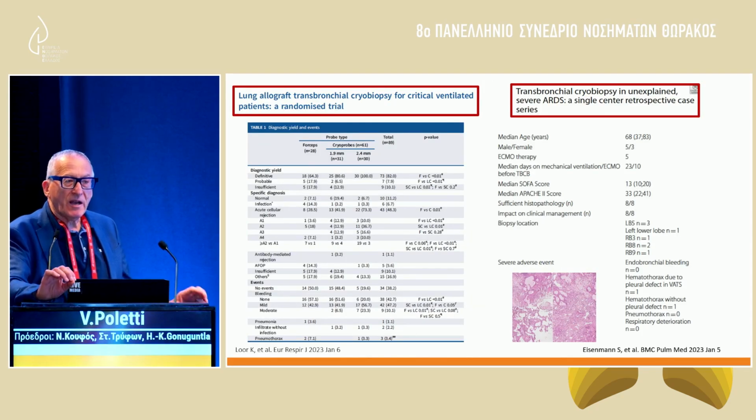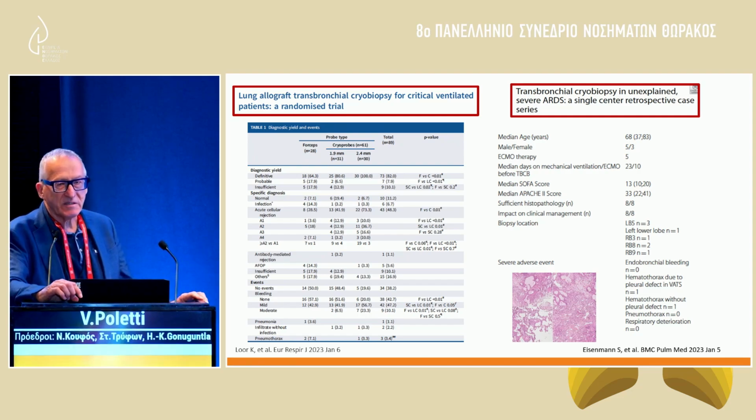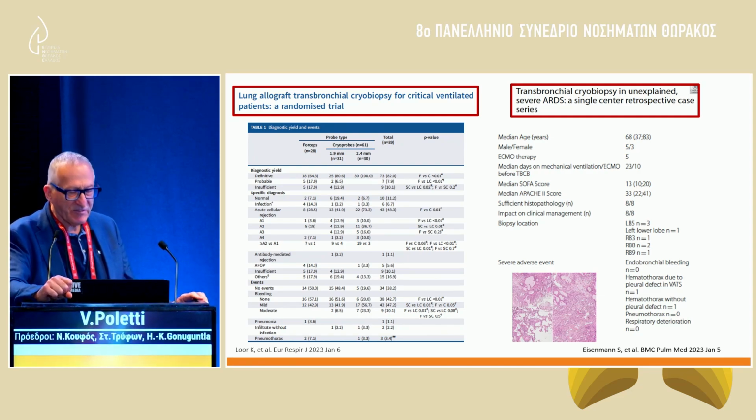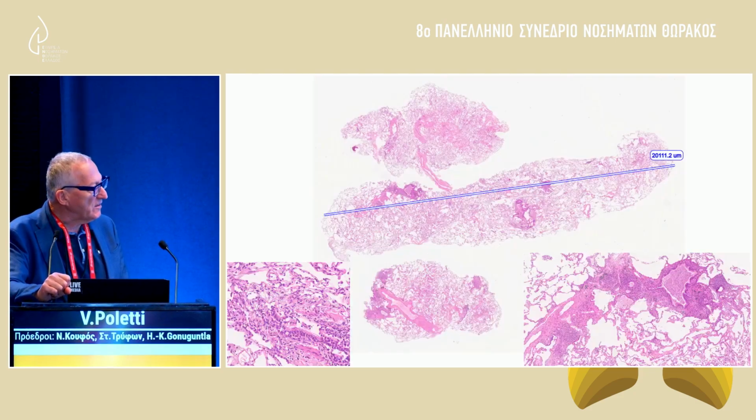But you can have cryobiopsy without any guidance, when you are in the ICU, and these are reports, case series, or even prospective studies, showing that if you have a little bit of experience, you can have cryobiopsy without any guidance. The pathological corner is very important.